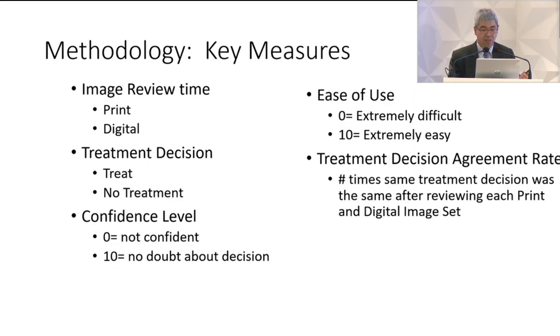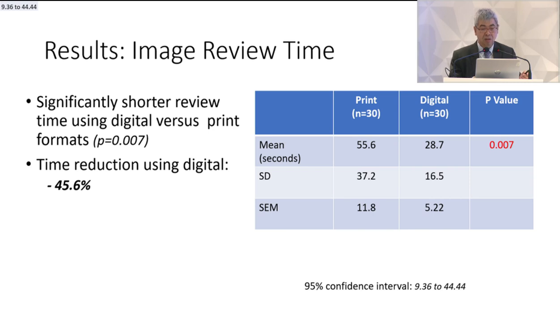These were our key measures. I found that there was a significantly shorter review time when doctors used the digital workflow to review the images versus the print format. And the reduction was quite significant. It was almost 50% reduction. So if it took a minute to review an image set using the print format, it took half a minute using the digital format. And if you have to look at 50 patients a day, this could add up in time savings.